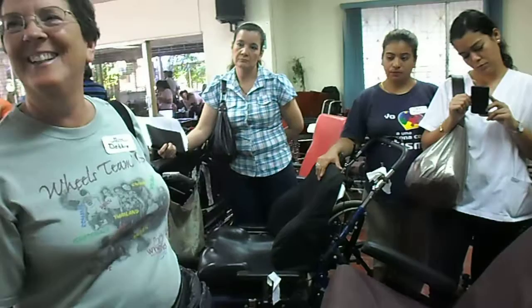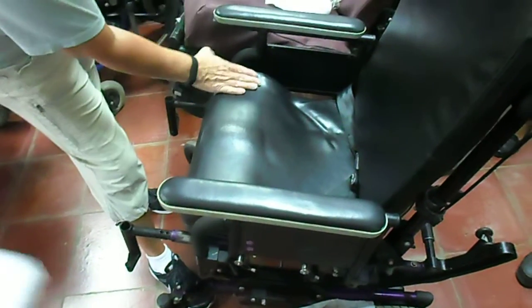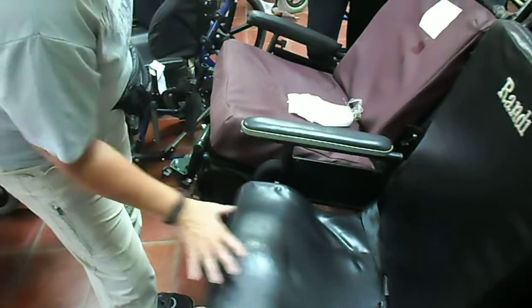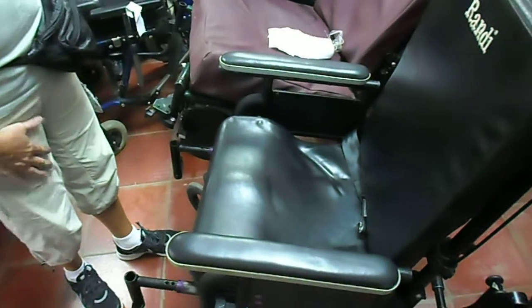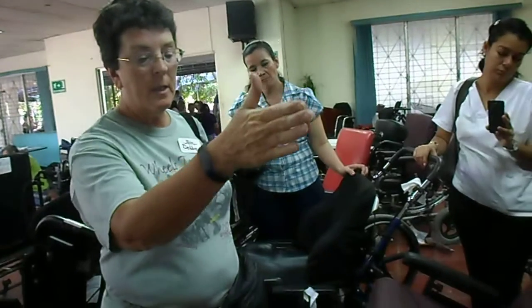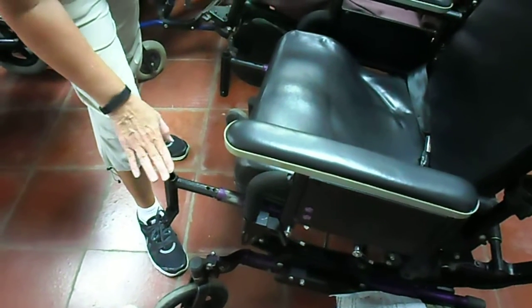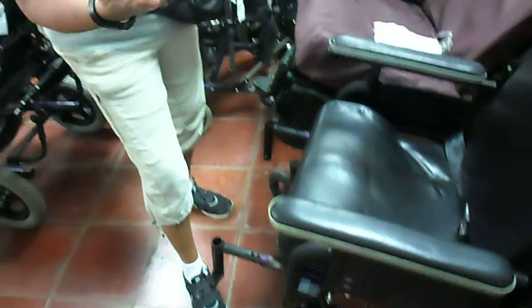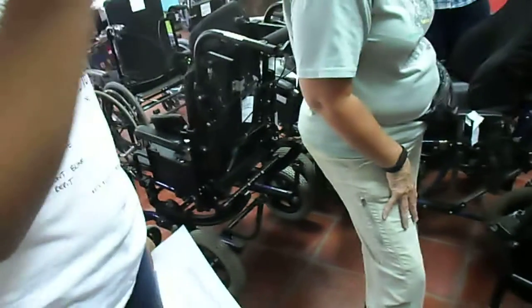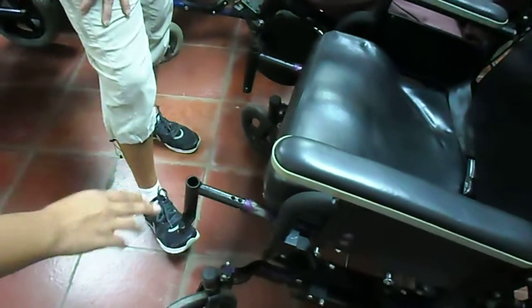Sometimes it works, sometimes it doesn't — so you try it and you see. This also has a little bit of contouring in the seat: it's cut out for the legs with a little bit of pommel in the middle to help them stay centered, spread out that base of support and give them more control. Remember we were talking about trying to maintain a knee angle of 90 and a hip angle of 90 — all of that. This is set up with holes here so that we can actually move where the footrest is attached in order to get more flexion or less flexion. Dependiendo de cómo sea mejor para mantener esa postura.